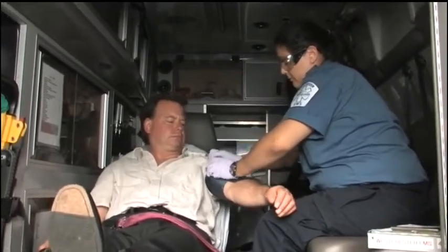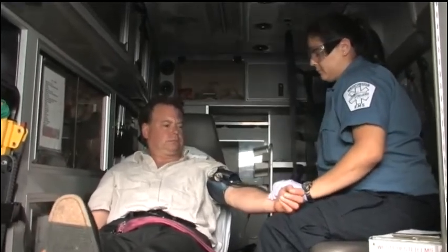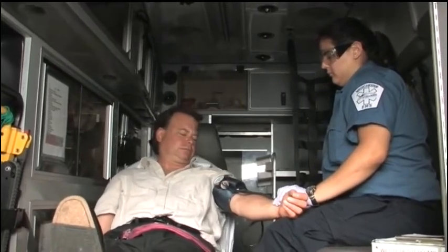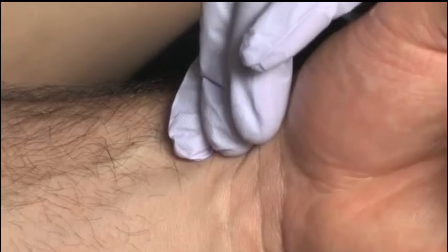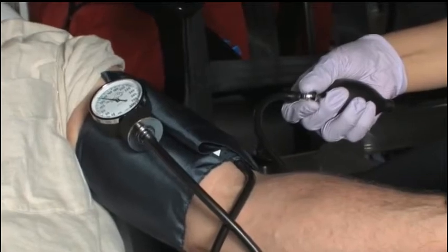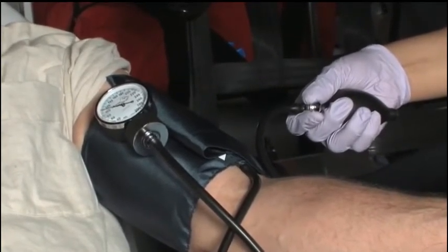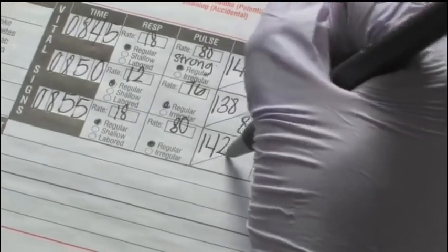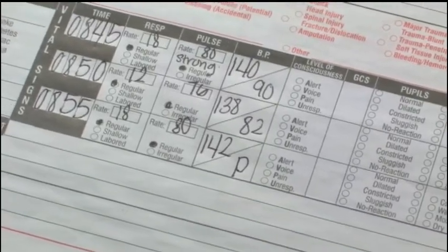The steps for palpating blood pressure are basically the same as used for auscultation. The obvious difference is that you do not rely on a stethoscope to hear the presence or absence of Korotkoff sounds. Begin by palpating for the radial pulse. Inflate the cuff until the radial pulse disappears, then slowly release air from the cuff until the pulse reappears. At that point, check the gauge for the systolic blood pressure. Report your findings as the systolic blood pressure over P for palpation, as well as the time of the reading.